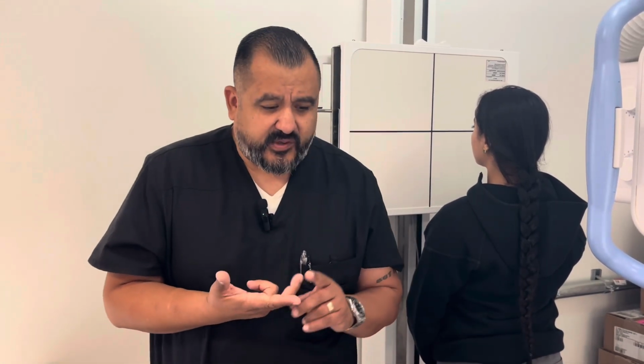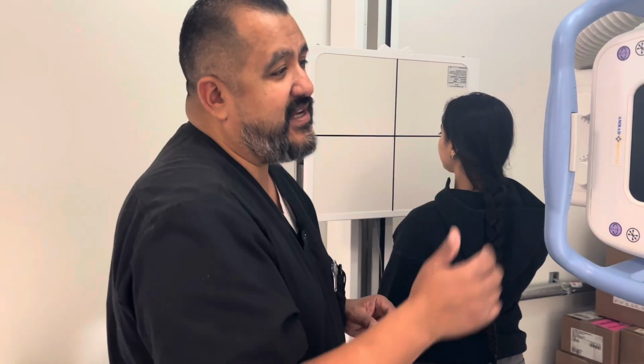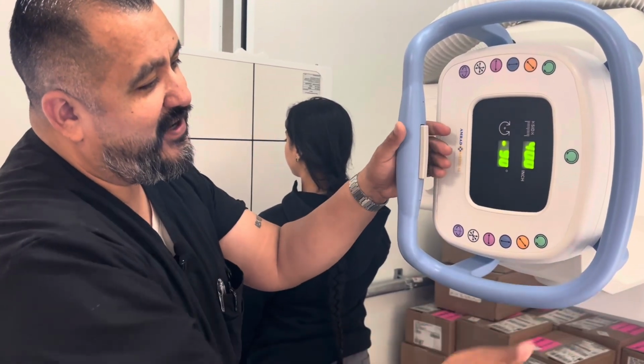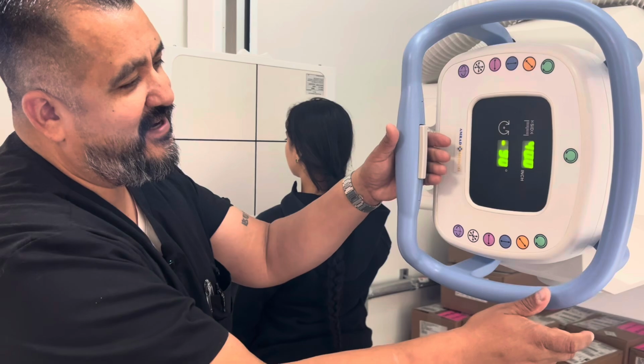But right now we're going to get started with the Caldwell, and we're going to do the Waters, and we'll do a modified Waters, and then we'll do a right lateral. You can do right or left lateral for the sinus, and we'll also mention what you're going to be seeing on these projections, okay? So we've got it at 40-inch SID. We're at 40. There we go. Oh, now we're 39.9. I got a little OCD when it comes to this. We're going to do a Caldwell.